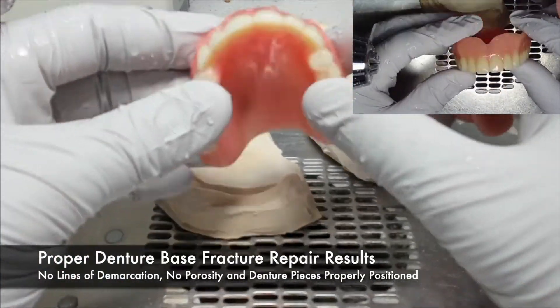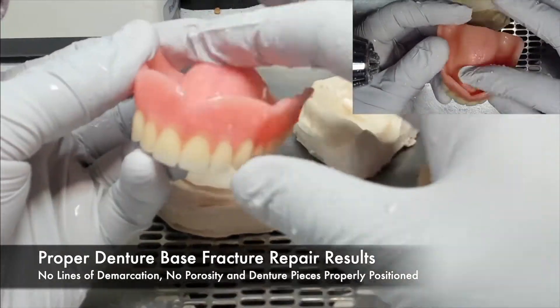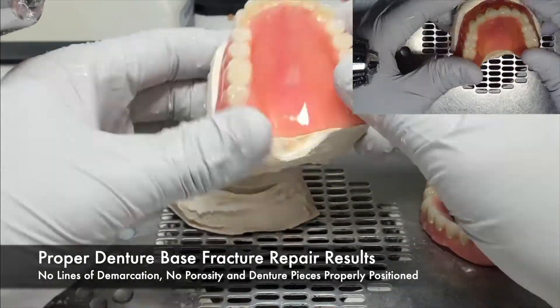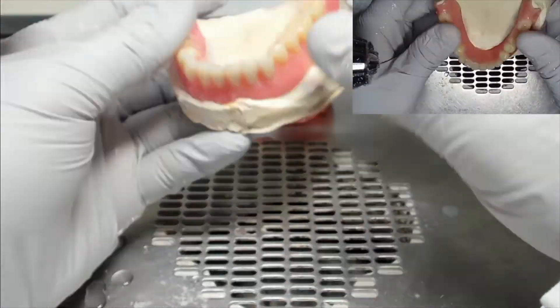A proper denture base fracture repair result will show no lines of demarcation between new and old acrylic, no porosity in the repair acrylic, and the denture pieces properly positioned in association to one another.